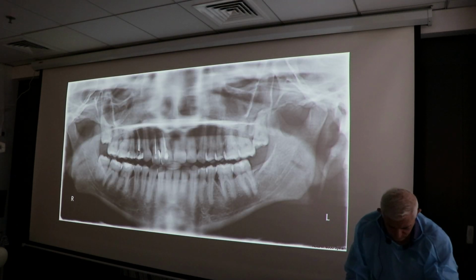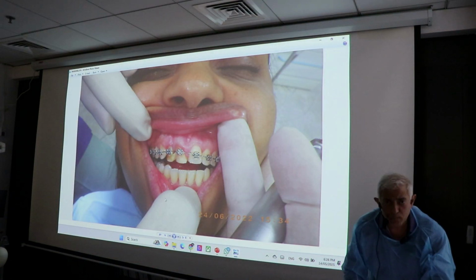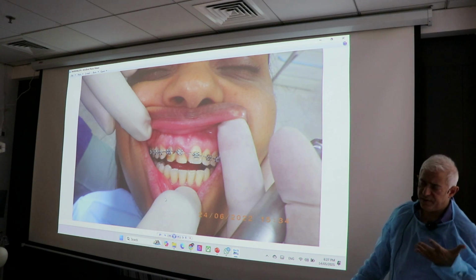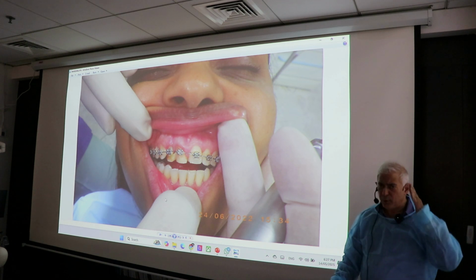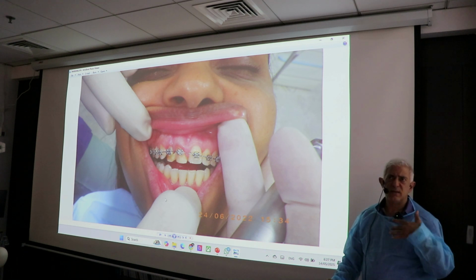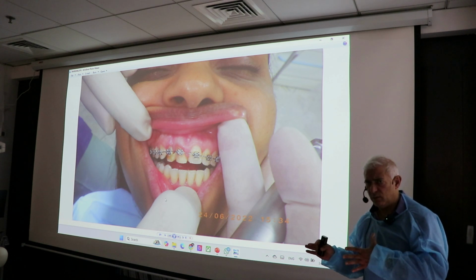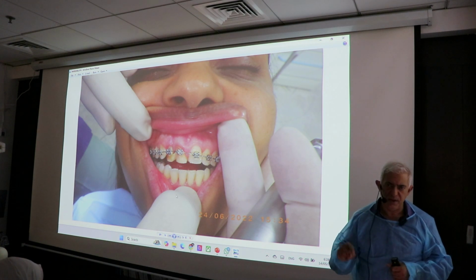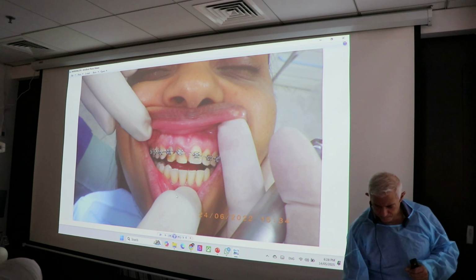All right, let's continue our surgical session. Doctor, how long does it take for the ortho? Half a millimeter a month. The orthodontist was very positive that it will take 1 millimeter a month. But till the time they put the bracket, till the time we are taking x-ray, making sure, I think it's better to say half a millimeter a month. But in the beginning, it's very slow. 8 months, half a millimeter a month gives you how much? 4 millimeter. So we got 4 millimeter.